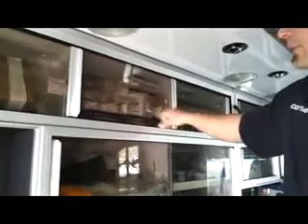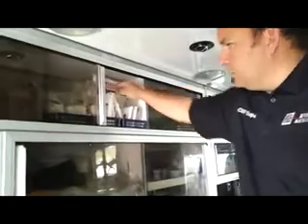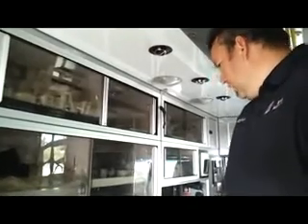All the compartments here are basically for wound control. If we have a patient that's bleeding, we can wrap them up with gauze type bandage and 4x4 bandages, band-aids, all the way from band-aids to trauma dressings here. If we have a major bleeding call, we can put trauma dressings on that. That controls the bleeding pretty good there.